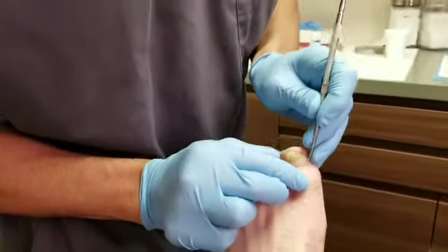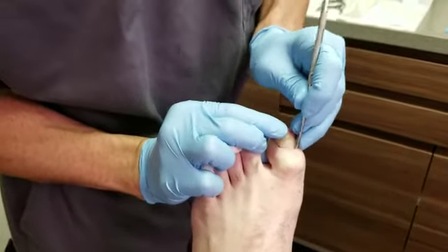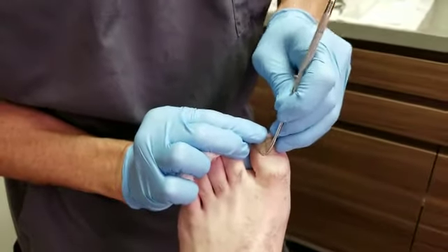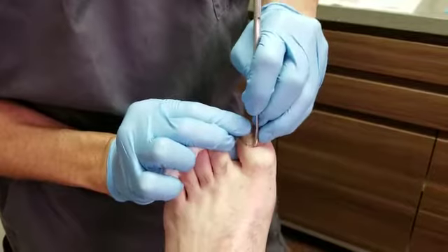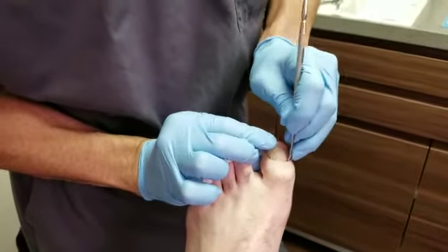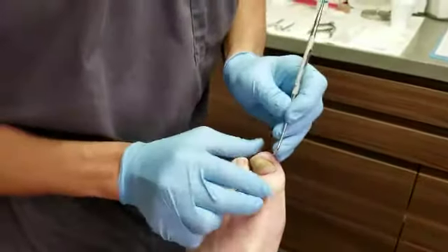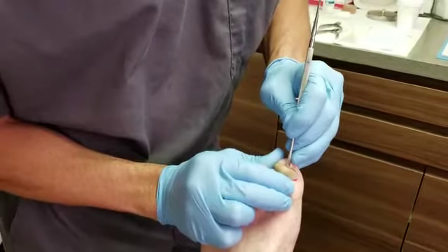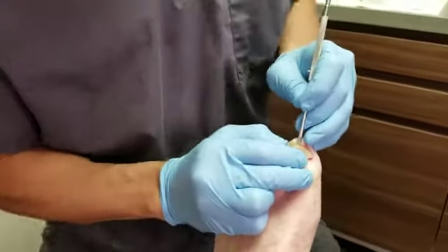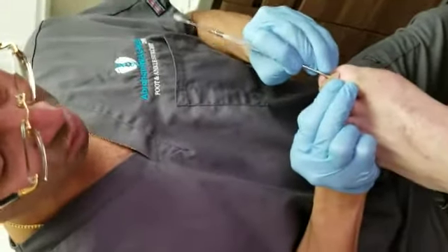The patient is numb and what we're going to go ahead and do is remove the nail plate today. What we basically do first is we release the skin on the back portion here, as we're doing such. We're going to slowly carve out the nail plate from the nail bed.